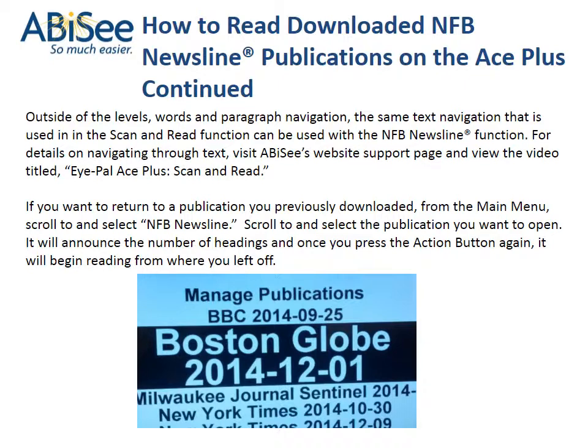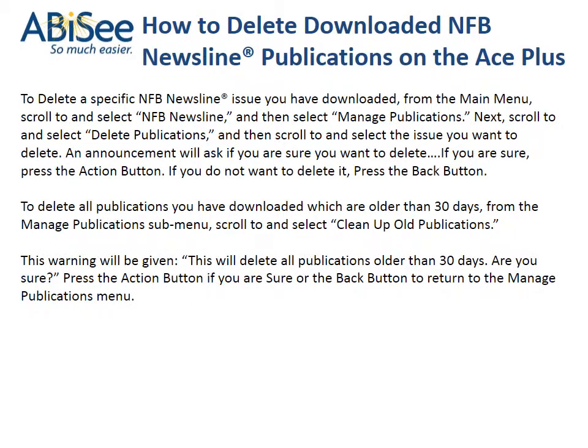If you want to return to a publication you previously downloaded, from the main menu, scroll to and select NFB Newsline. Scroll to and select the publication you want to open. It will announce the number of headings and once you press the action button again, it will begin reading from where you left off.